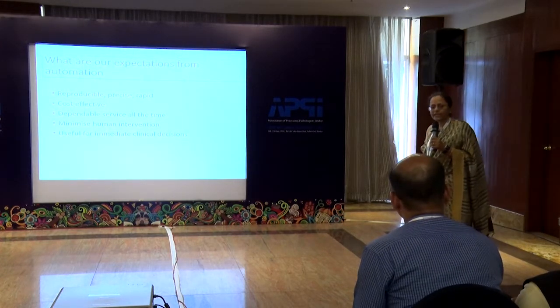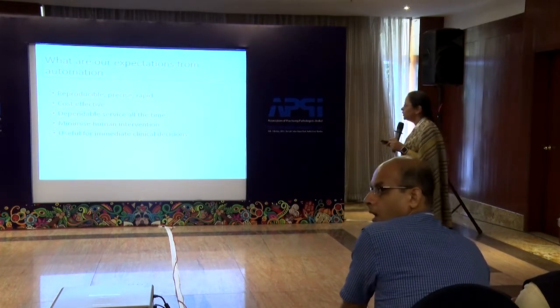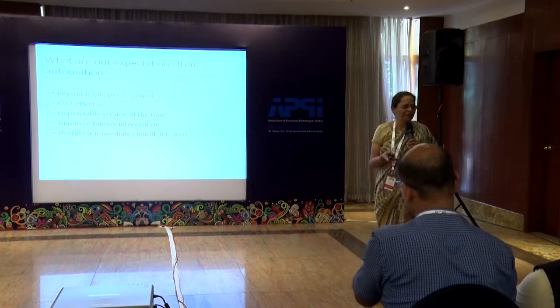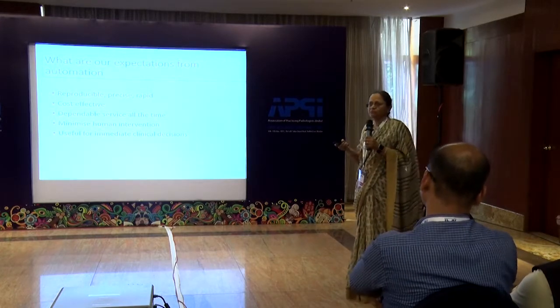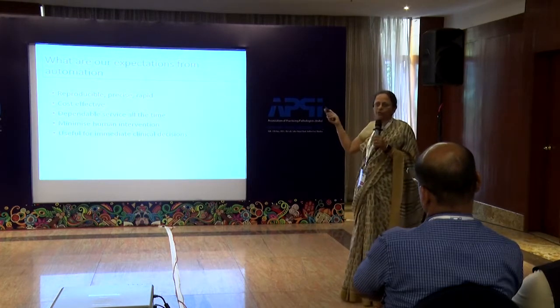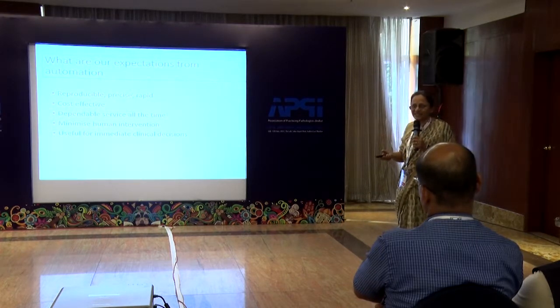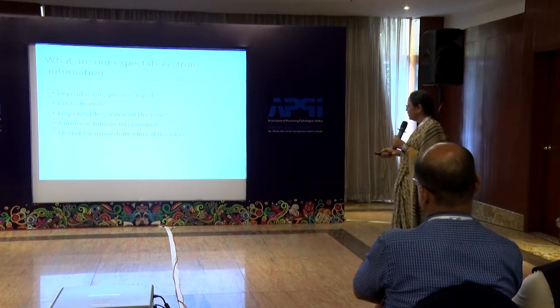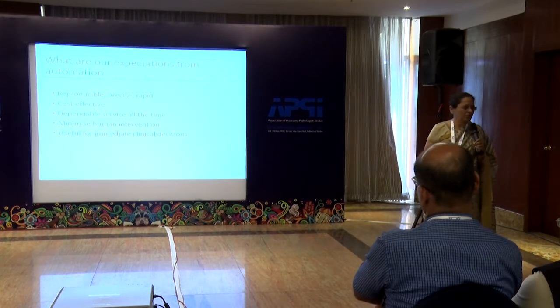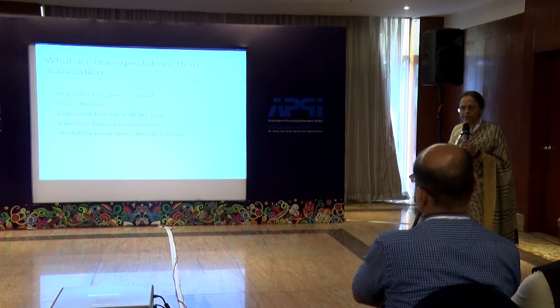Having moved, what do we expect? We expect that automation should give us reproducible, very precise results. Like Dr. Sharavanan was trying to point out, people want reports as soon as you've drawn the blood; they're already waiting for the report. They tell you that if I go to the other lab, they give it at this time. So instant gratification has extended to this too: immediate, or at least rapid, results. Definitely everybody has become cost conscious. We also should be cost conscious, those of us who run laboratories.